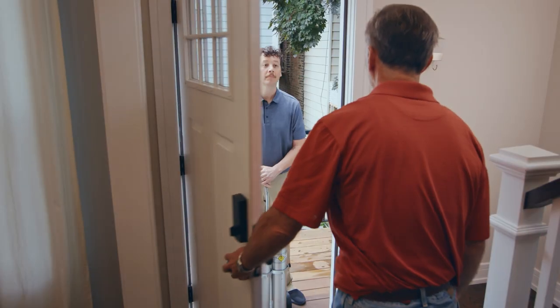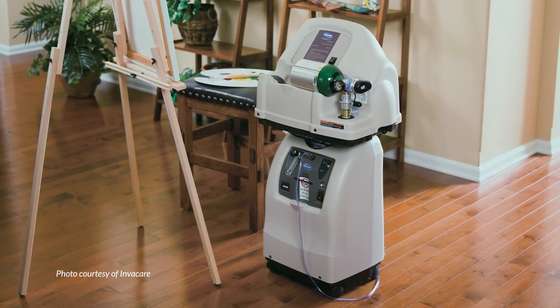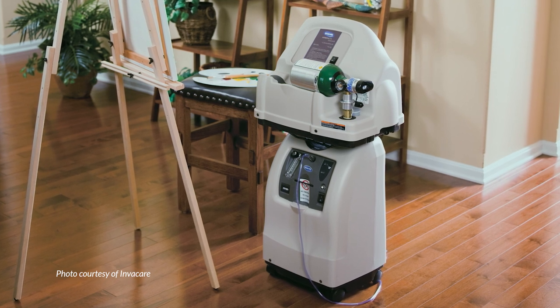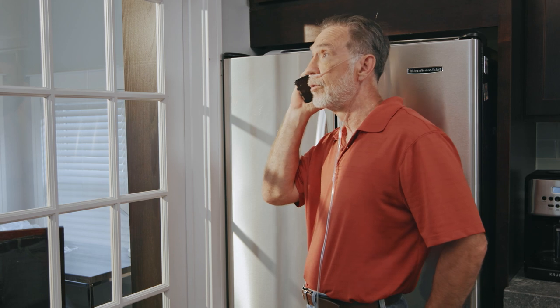Your oxygen delivery company will drop off new tanks when it's time for a refill. Some people use a special device called a home fill system that allows them to refill their own tanks. Ask your doctor if this is right for you.